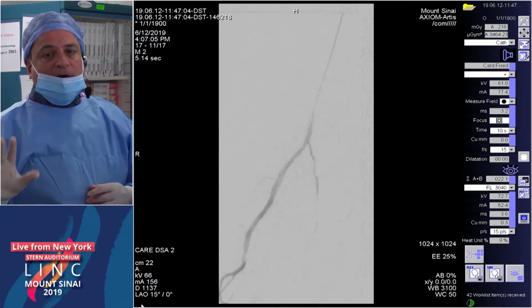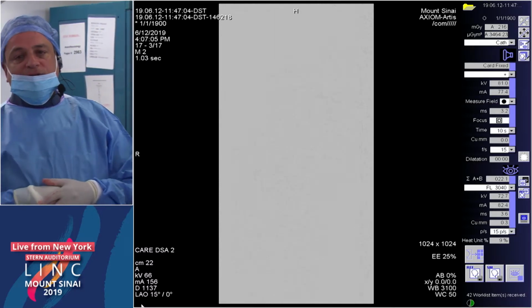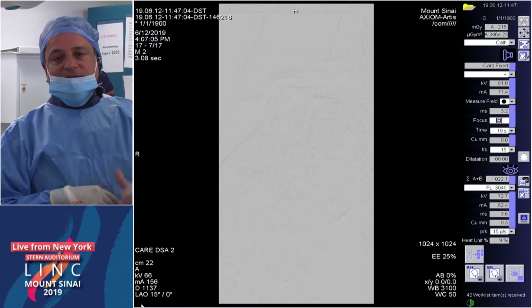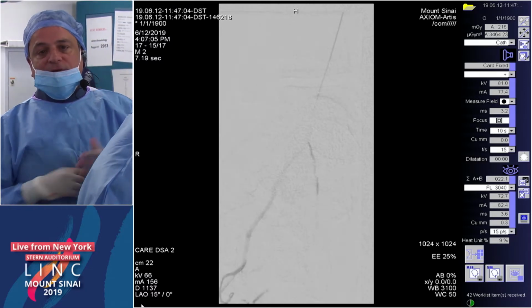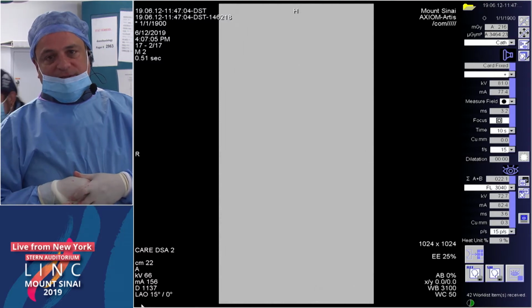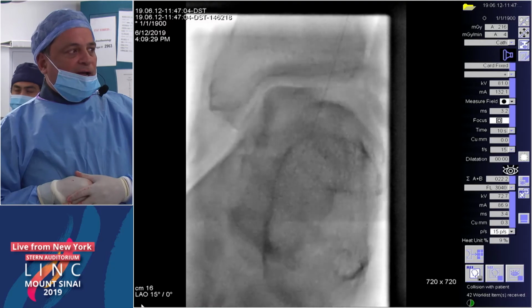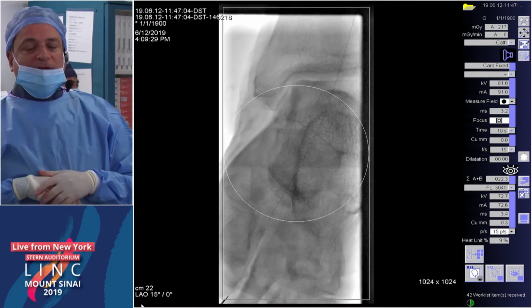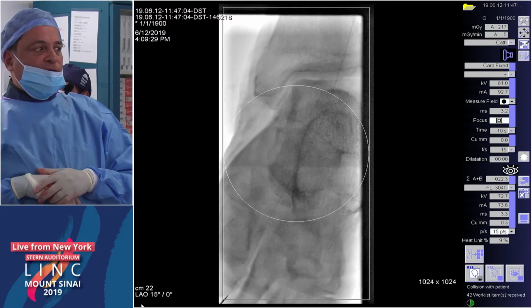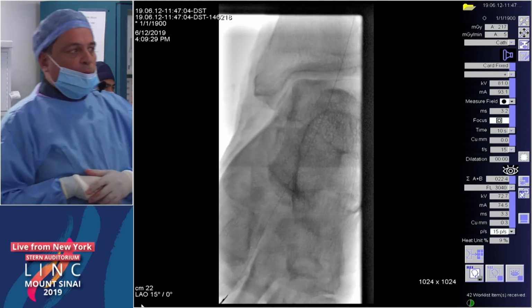So I know we're probably out of time. I just want to let the audience know, we're going to do an IVUS, directional atherectomy, balloon angioplasty, and then if we need to do provisional stenting, we'll use a DES. So I think this is a nice demonstration of an antegrade cross. And if we have time, Mike, we'll stick around, but I know we have to go to the other one. I don't know whether you have lectures, and you can just leave us on one side while we work here, and we can work while you guys do lectures.